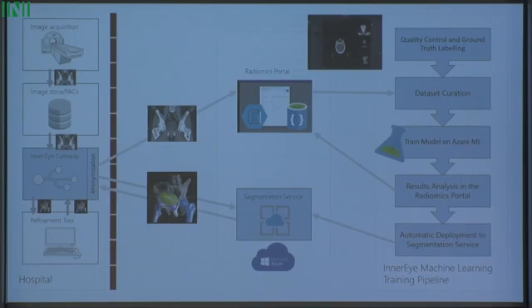The second part to the right is training new machine learning models. As you can imagine, in addition to the machine learning or the deep learning, there's a lot of tooling that's required to actually build these models in a principled, repeatable, and robust manner. To do that, we have tools to filter data, tag images, and correct segmentations, as you saw with the radiomics tools.